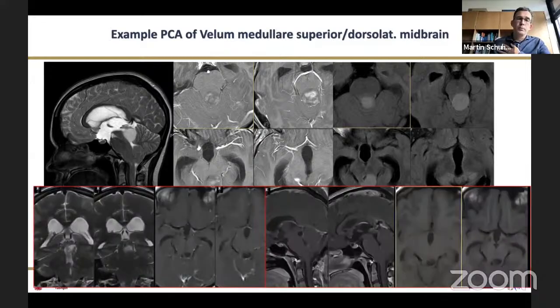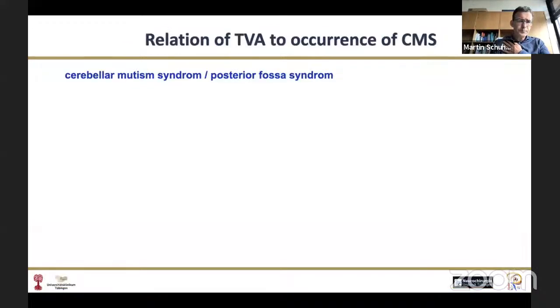And this is the immediate postoperative scan. This case was a few weeks ago. And we think we have reached a gross total resection in this girl without any sequelae, just a little bit of paresis or double vision for a few days until discharge.